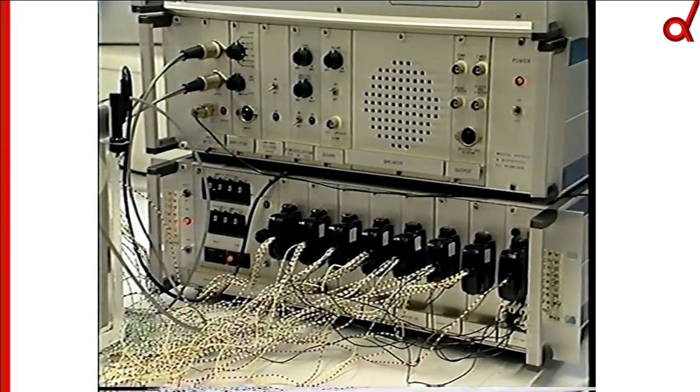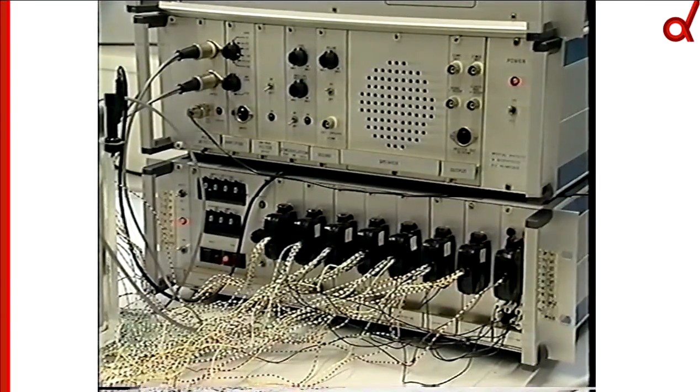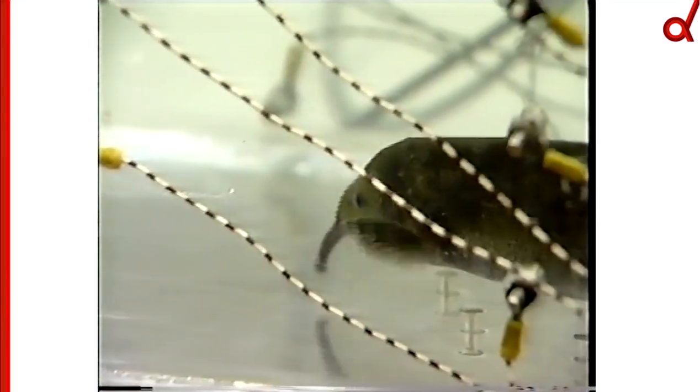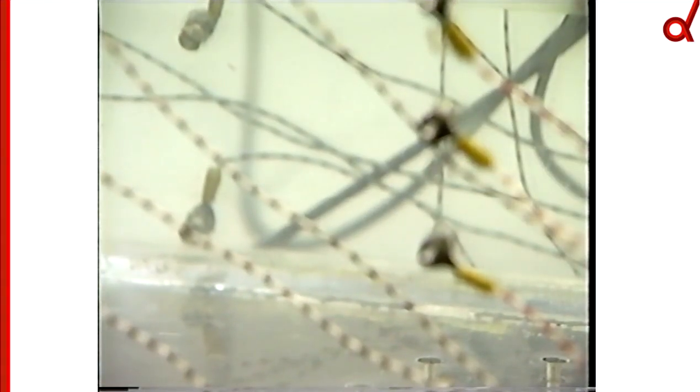We will later see the idea of this is basically source reconstruction. We have an EEG, we have a water tank, which is our forward model or our volume conductor, and then we can just localize the position of the fish in the water. That's what you are currently doing now, trying to localize the source in the brain. You can look at the brain like a water tank, but there are more sources than just one fish. So this is a very, very simplified version of source reconstruction.